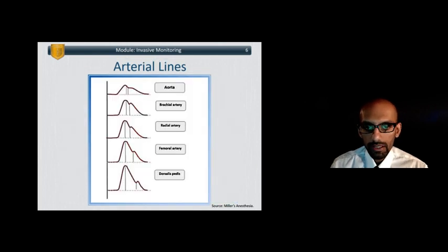And reviewing generalized principles of invasive pressure waveforms. As you progressively get further and further away from the central pump, your waveform adopts a lot more ringing and resonance because of all the wave reflections that have bounced back and forth against arterial branch points, and then summate to basically create a lot of oscillation and resonance in your waveform, especially all the way when you get down to the dorsalis pedis artery.